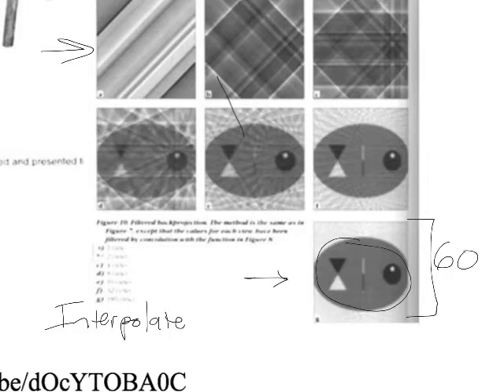There's also a ton of information about what the density of that thing is, and we will call that an attenuation profile. And we'll unpack that term quite a bit more. So just put that off to the side: through this process of creating image data, we've got both spatial representation as well as attenuation profiles.